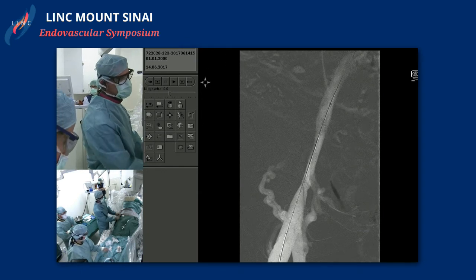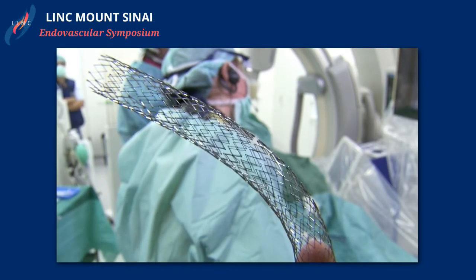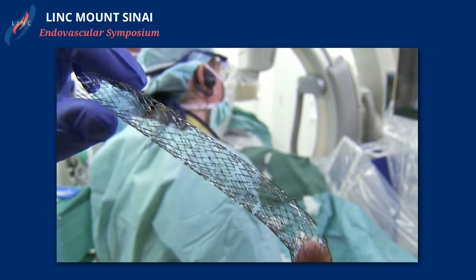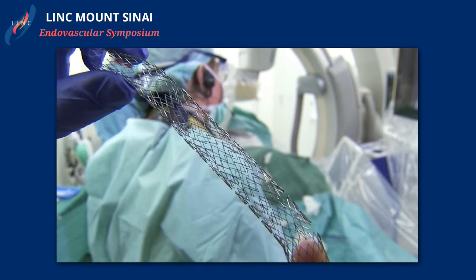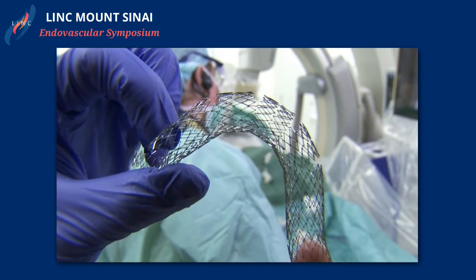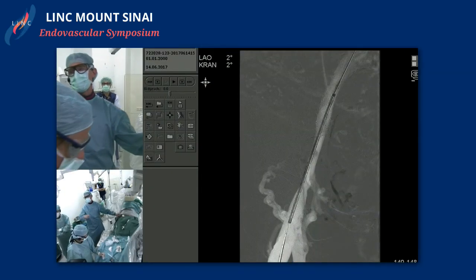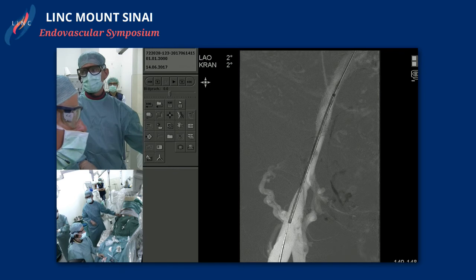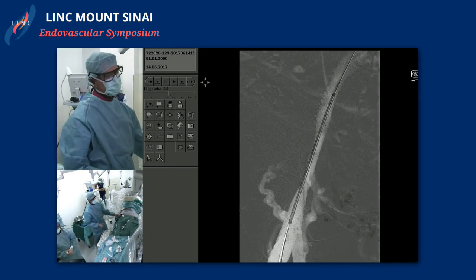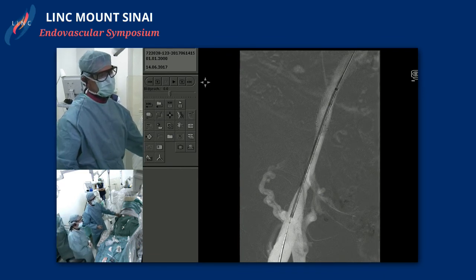Can you tell us what's the length of the stent you're going to place in the external iliac vein? It's 12 centimeters. Could have been a little shorter. What do you think? I would stop here, actually. Something like here. Did we go back to the fluoro image? We're looking at the stent now, which looks very nice, an open cell stent. I would want to be like 5 millimeters higher than that, just so that you don't completely cover that critical collateral there. Exactly.